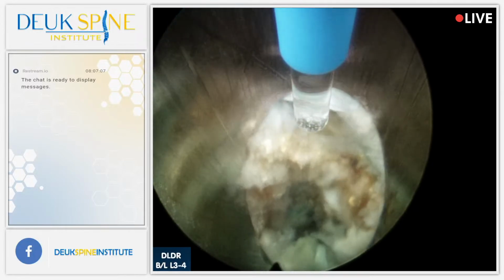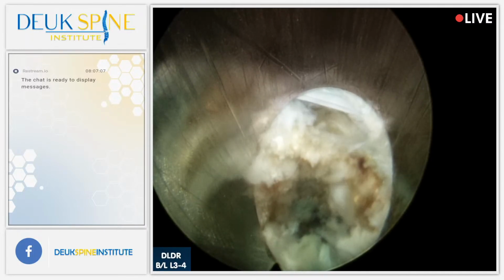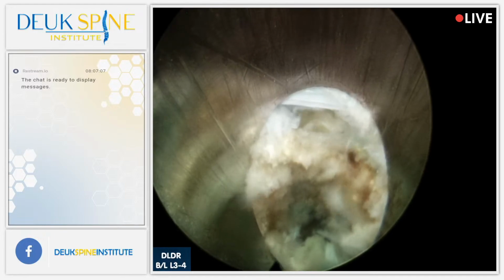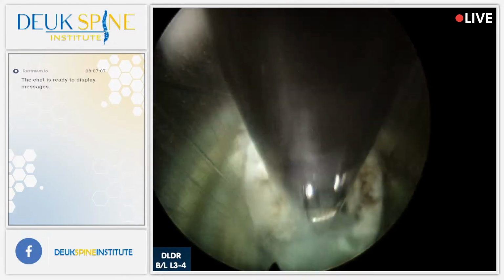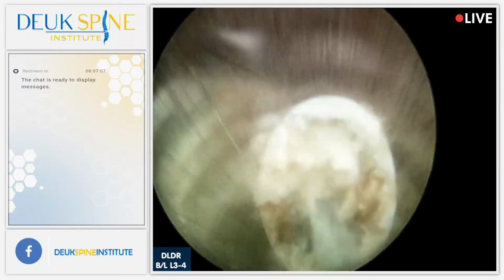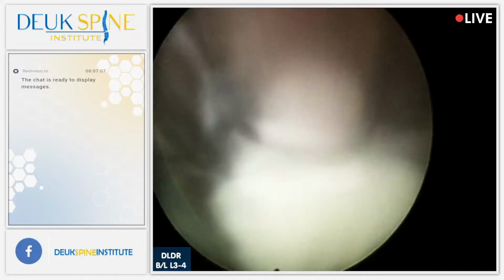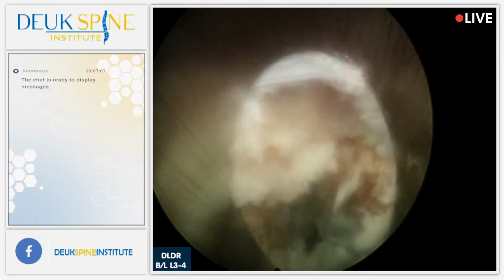So I'm going to wait a minute. Let me have a grabber. I'm going to see if I can grab out a piece of herniation while we're waiting. This is the back of the herniation, by the way, right where it interacts with the neural foramen, where the nerves are. As a matter of fact, we'll try to look and see if we can see one of the nerve roots.